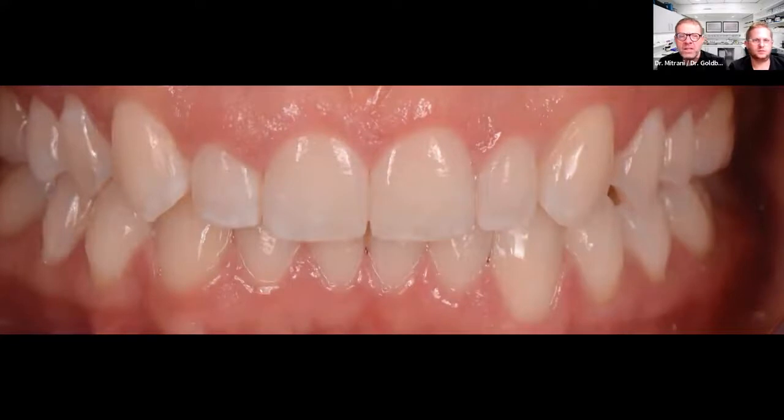In this close-up view, we could readily see that even though the laterals are really small, there's still a lack of that dominance of the central incisor that we typically like to see aesthetically, where the gingival margins of the centrals normally coincide with the gingival margins of the canines. And so this is what this picture looks like.